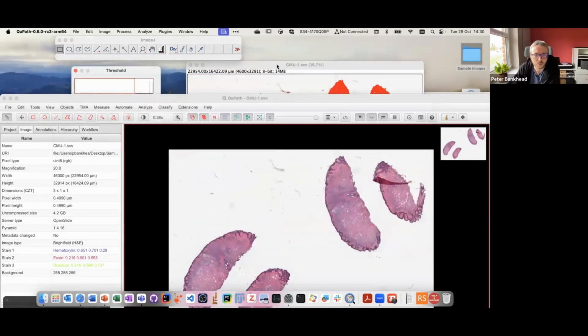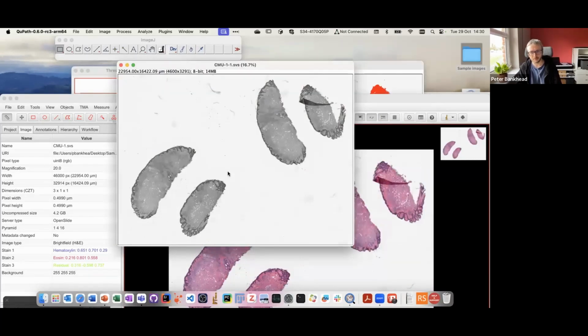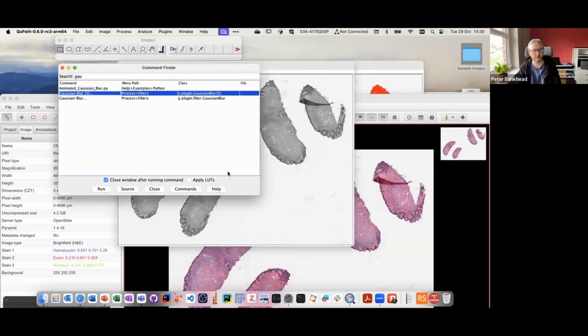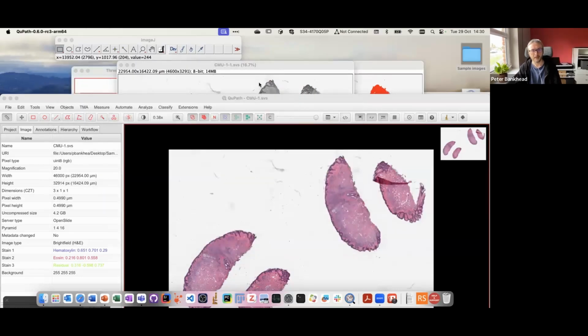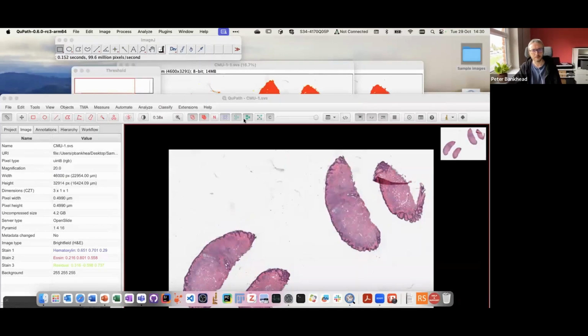Let's suppose that we want to apply thresholds to this image, generate regions of interest, and get these back into QuPath. So I've sent off my small region to ImageJ. Once I'm in ImageJ land, I can do all of the normal stuff. I can duplicate images, apply Gaussian filters, apply thresholds and so on, and I can do things like create selection.